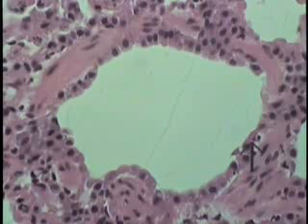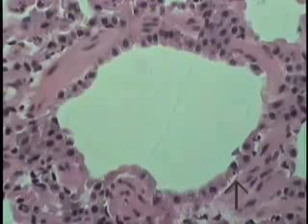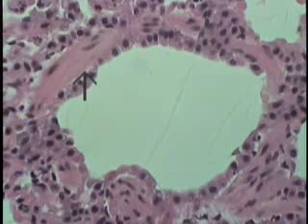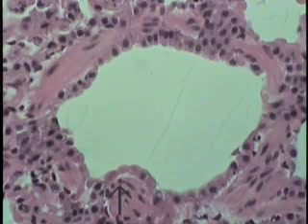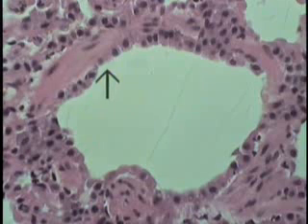The terminal bronchiole, as seen at increased magnification, shows the simple cuboidal to columnar lining type of epithelium. It retains a smooth muscle wall, though it's beginning to form a spiral type structure. And these vacuolated, non-ciliated cells at this point may indeed be Clara cells.